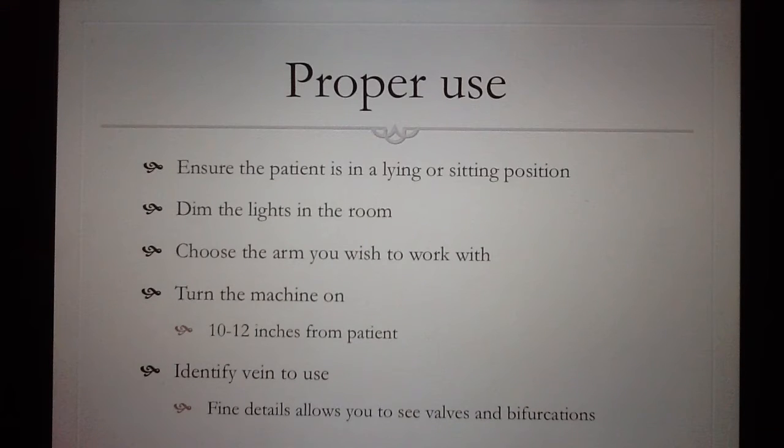Proper use of the Vain Viewer Flex: ensure that the patient is in a comfortable lying or sitting position. Dim the lights in the room to ensure that the near-infrared light can be viewed comfortably. Choose the arm that you wish to work with carefully, ensuring that there are no valves or bifurcations in the way of the IV insertion site. Turn the machine on and make sure that it's no more than 10 to 12 inches from the patient. This is key for the near-infrared light to be optimally viewed from the practitioner's standpoint.